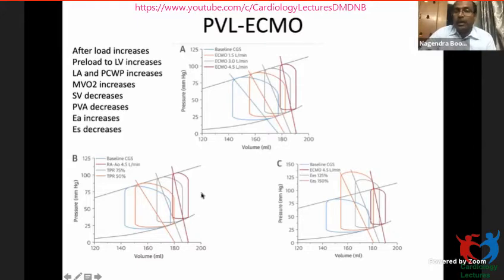Whenever these are all hemodynamic studies, we don't know yet whether it is essential to put an afterload reducing agent like IABP or Impella whenever ECMO is being placed. But these are all the hemodynamic things that have been shown in animal studies and some clinical researches.